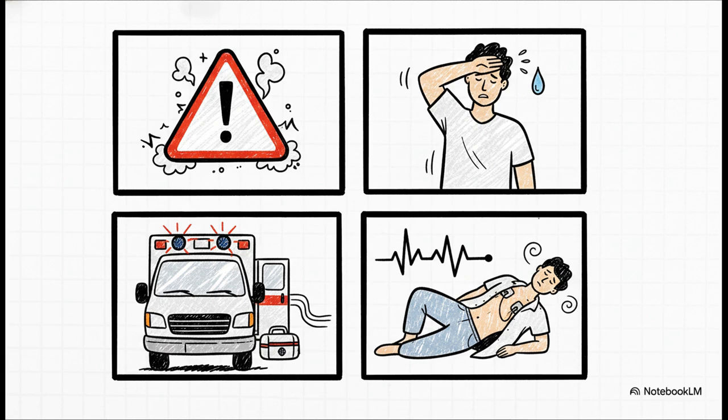Now, if they do wake up, roll them onto their side into the recovery position so they don't choke if they happen to vomit. But listen closely to this. Keep the AED powered on and keep those pads attached. It's going to continue monitoring their heart every 2 minutes just in case they arrest again.